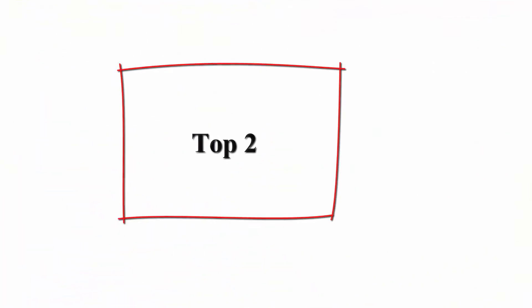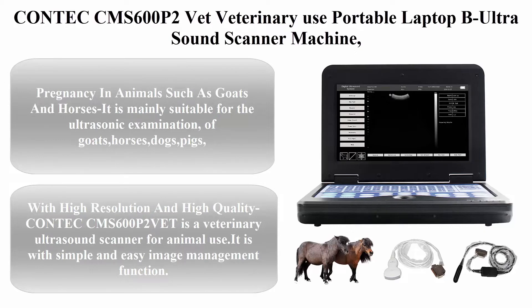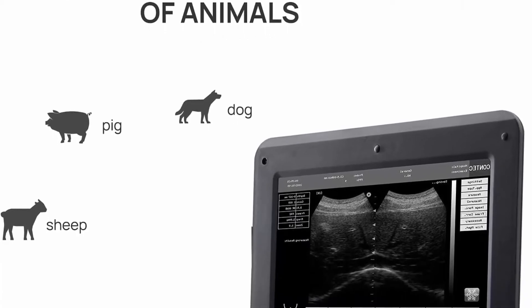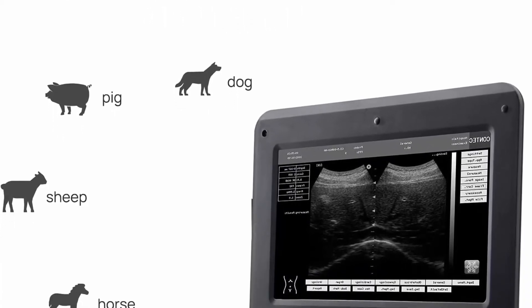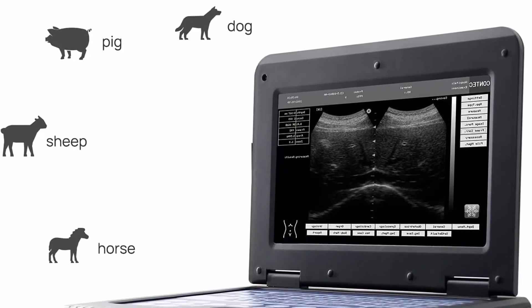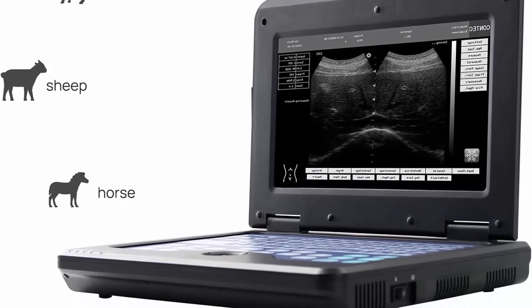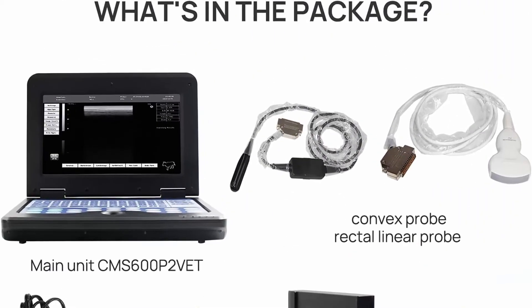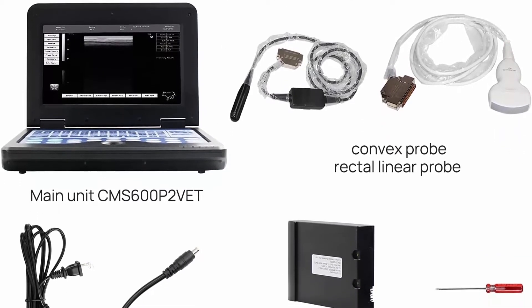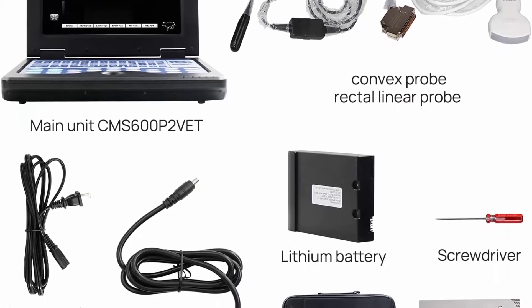Number 2: Contec CMS600P2VET Veterinary Use Portable Laptop B Ultrasound Scanner Machine for horse, equine, cow, and sheep use, including pregnancy in animals such as goats and horses. It is mainly suitable for the ultrasonic examination of goats, horses, dogs, pigs, cows, ponies, and mares. It comes with two probes: a 3.5 MHz convex abdominal probe and a 7.5 MHz rectal linear probe with frequency range 5.0–10.0 MHz.